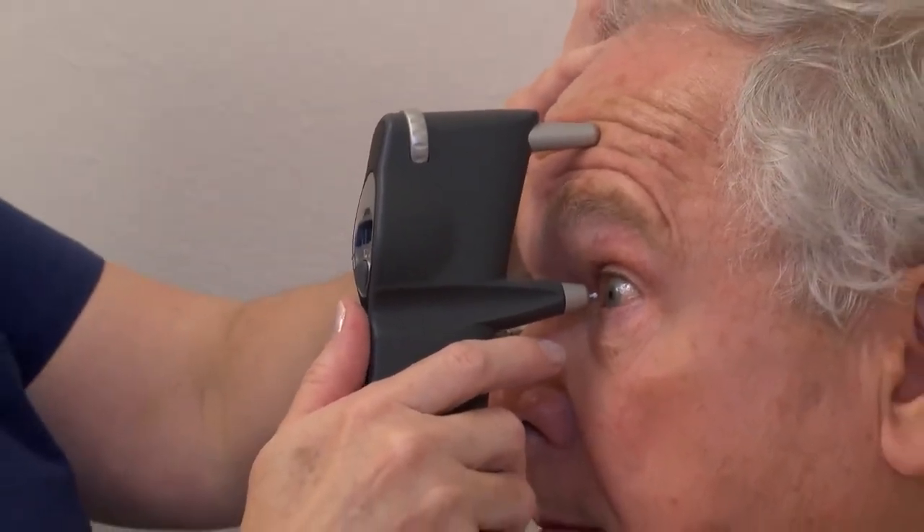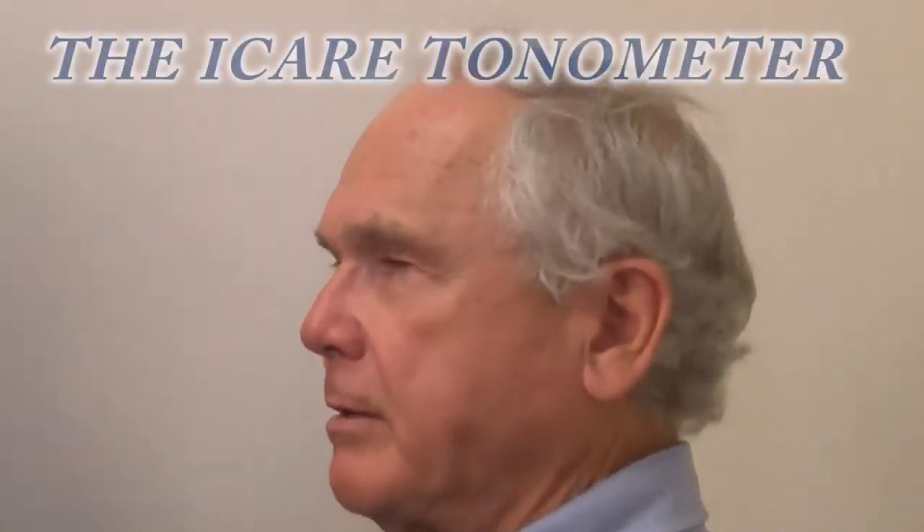We're going to do six readings. Single beep — it's ready. Pressure 16. Did you use any anesthetic? No anesthetic at all. It's just topical. I can just barely feel it. It didn't bother me at all.